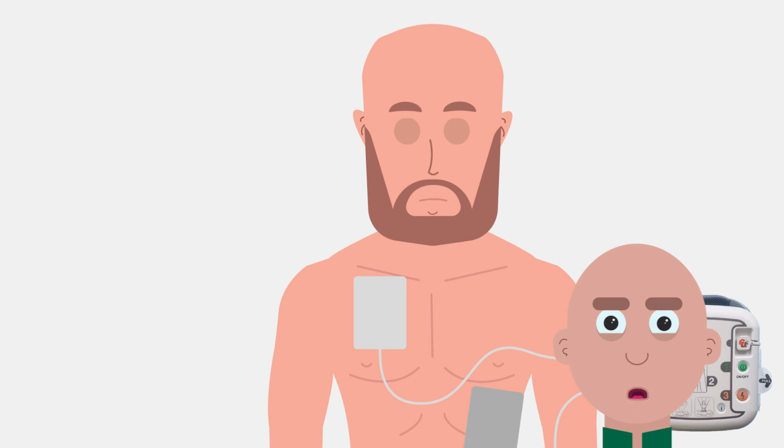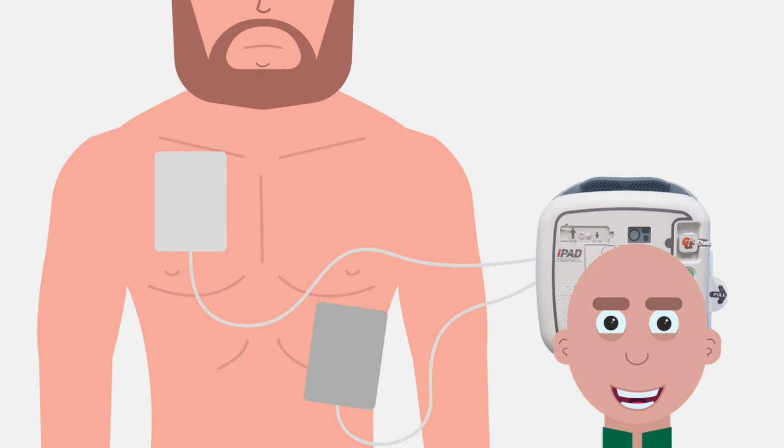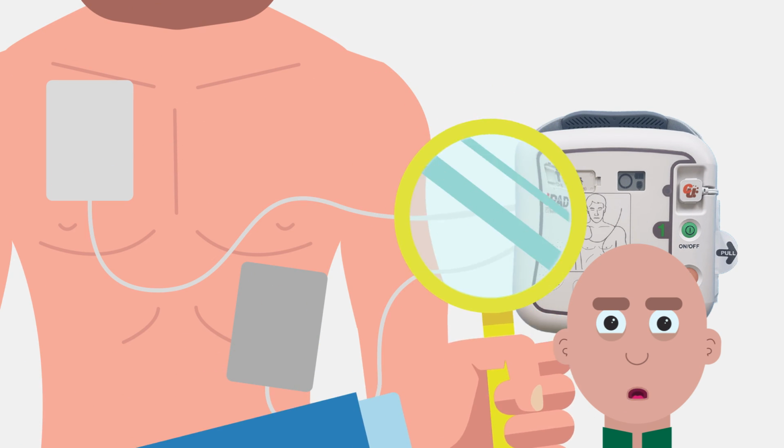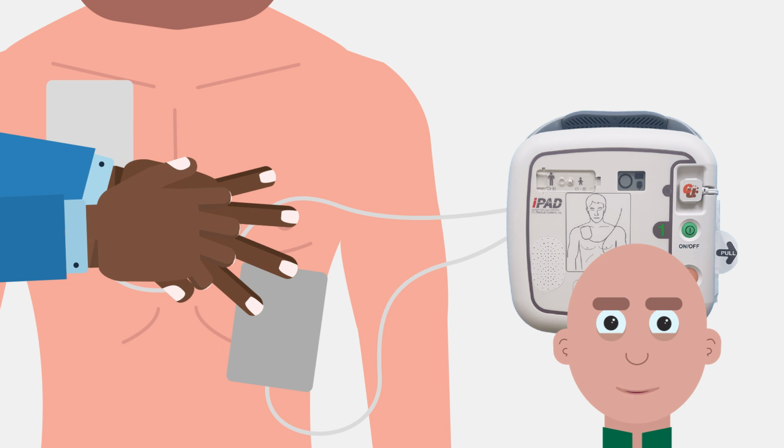If the casualty shows signs of becoming responsive, such as opening eyes, coughing, speaking, or starting to breathe normally, put them in the recovery position. Leave the defibrillator attached, monitor their response, and prepare to give CPR again if necessary.